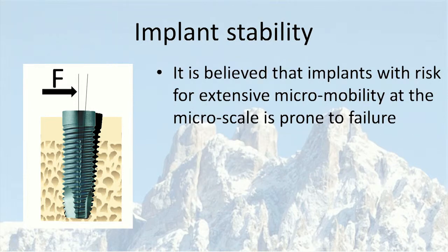It is believed from the experiences with the implants, and we soon have 50 years of experience with osseointegrated implants, that historically we have seen more failures with implants placed in soft bone, short implants, grafted bone, in situations where the biomechanics are somewhat compromised.